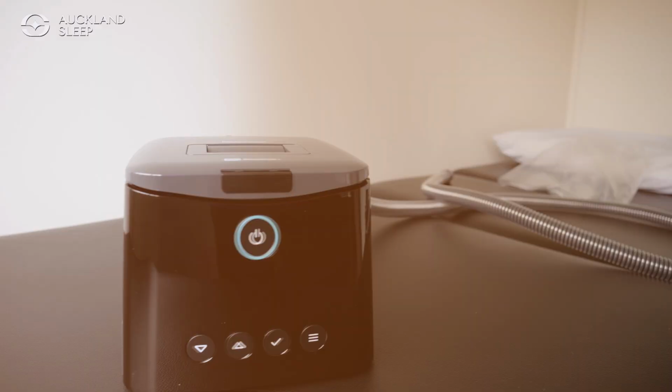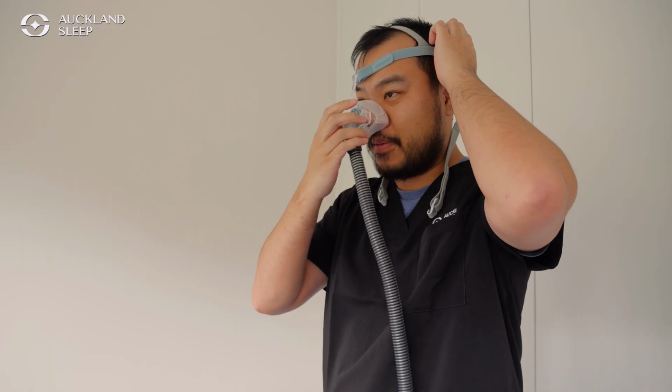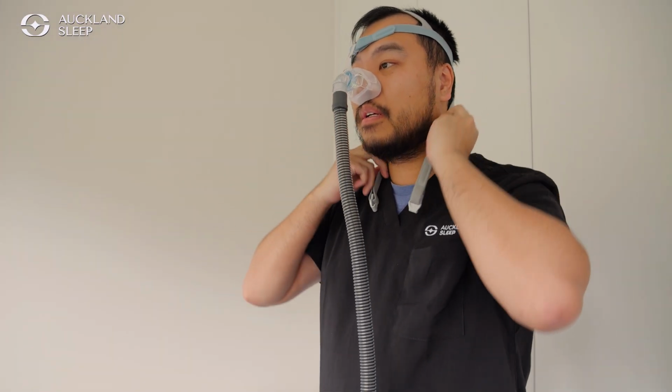So CPAP stands for Continuous Positive Airway Pressure. Essentially, it's a device that gets used for patients who have obstructive sleep apnea or other forms of sleep-disordered breathing. The whole point of CPAP, of course, is to provide pressure support to open up the airway to treat obstructive sleep apnea, which is, of course, the collapse of the upper airway. So that, in turn, helps patients sleep a lot better.